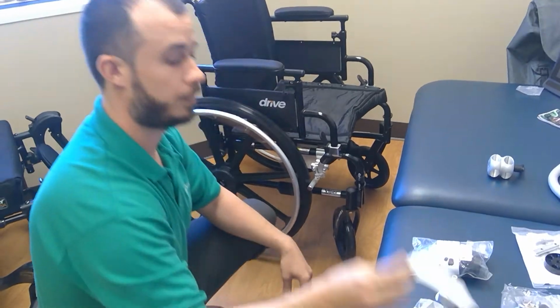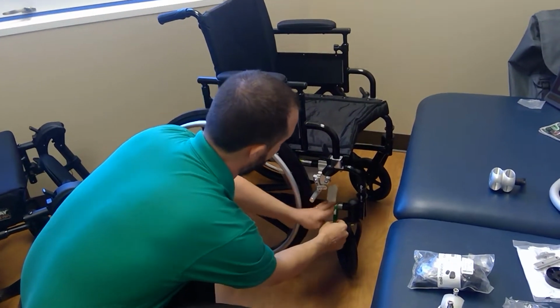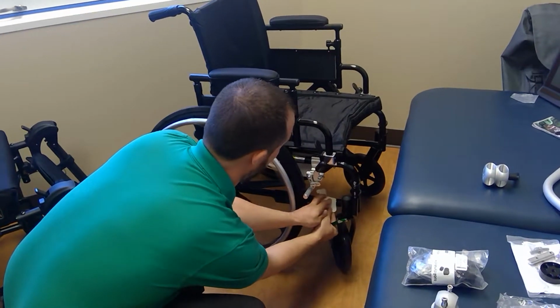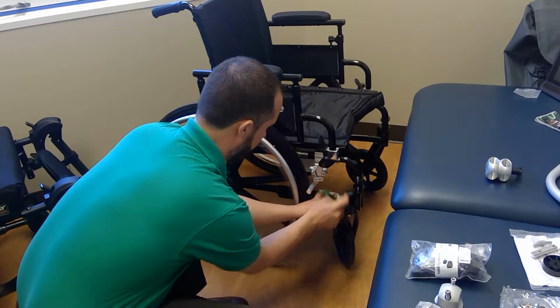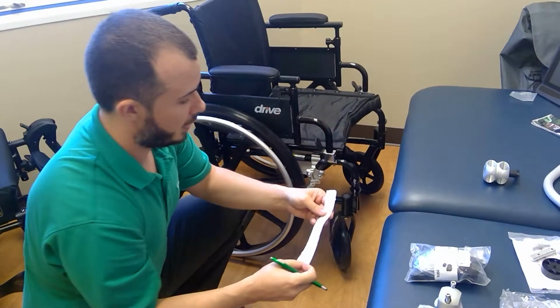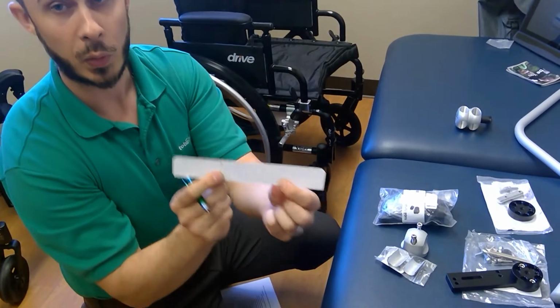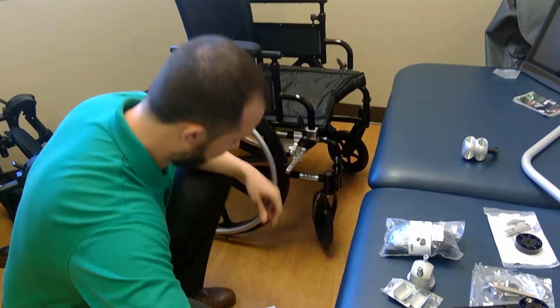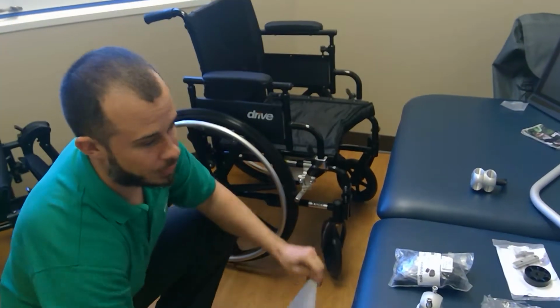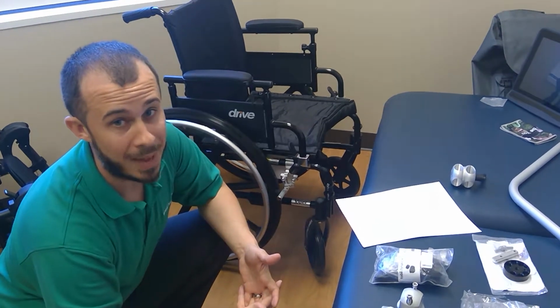Find a strip of paper and wrap that piece of paper around the tube, and then draw a line to connect those two pieces of paper. So you'll see between those two lines, we would take a tape measure and we would measure the distance between those lines, right? So what that's going to give you is the diameter of that tube, or I'm sorry, the circumference of that tube. So we're going to go back and we're going to do a little bit of math, right?